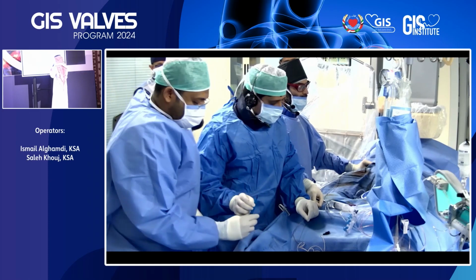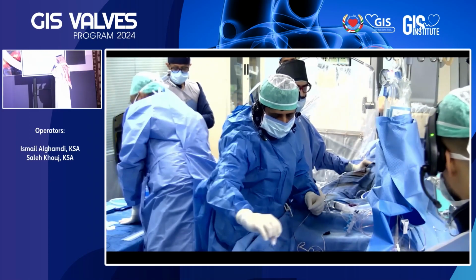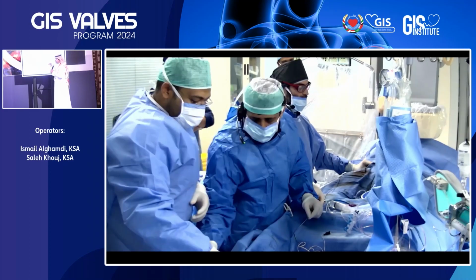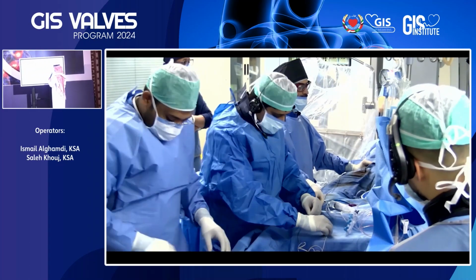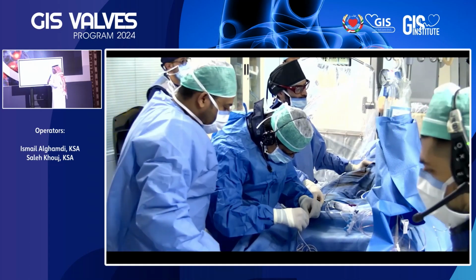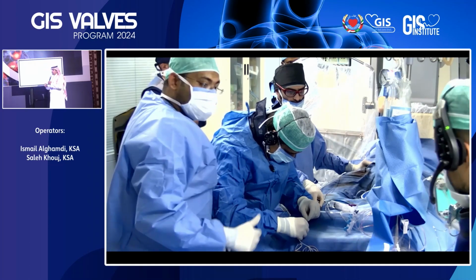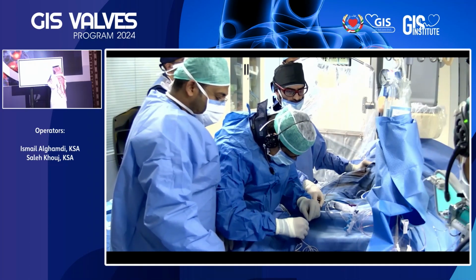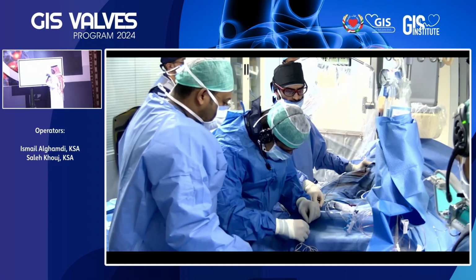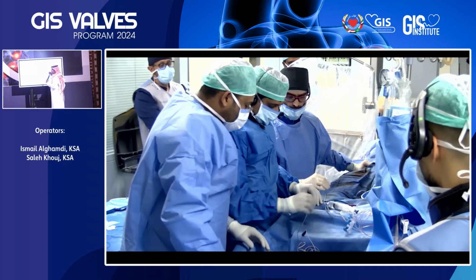So the perimeter at the annulus level was about 82 millimeters. And when you go 4 millimeters up, you find that it's about 79.4. When you try to assess your size, you have to take those factors into consideration. This is one of the shapes that you might get when you do an assessment of the bicuspid aortic valve, and this is called taper shape.